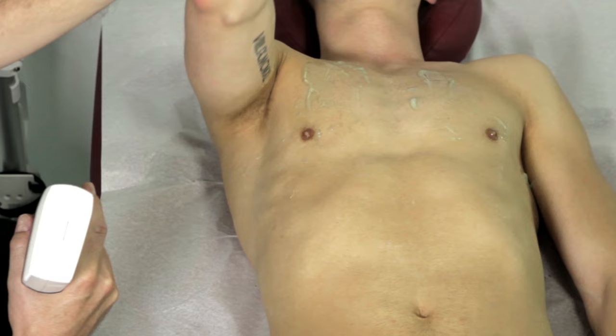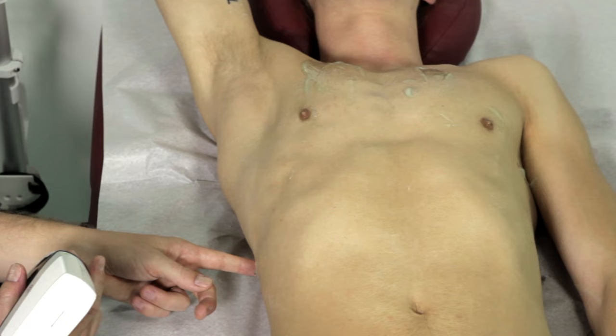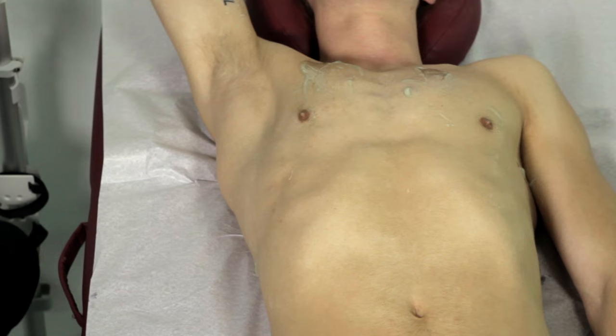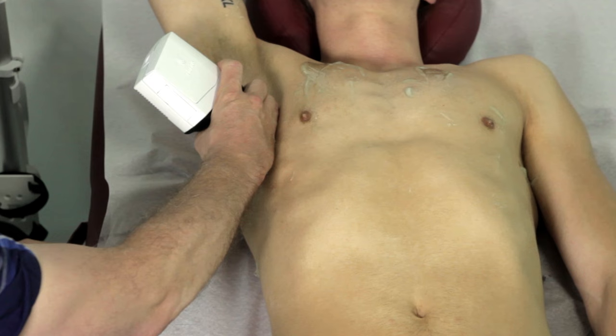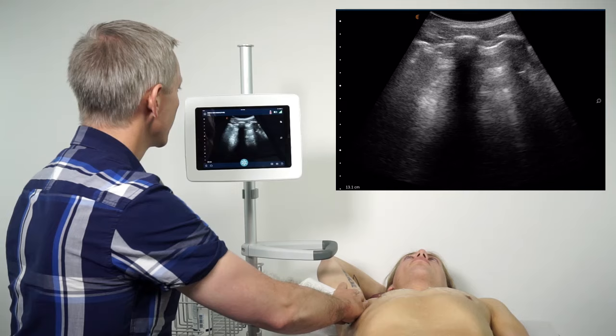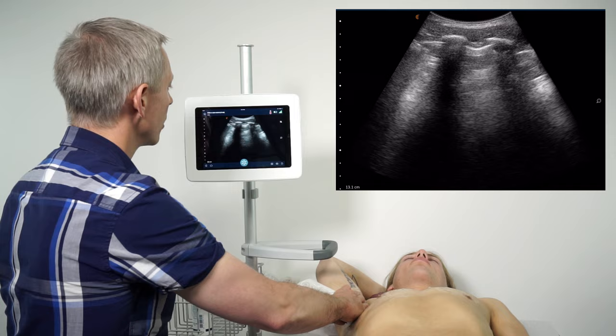I'll move on to the lateral lung zone. I'll get the patient to place his hand above his head, exposing the lateral aspect of the chest. The lateral lung zone is divided by the anterior and posterior axillary lines, and again I'll divide it at about the level of the nipple into superior and inferior portions. For the superior zone, I'll place the transducer in about the mid-axillary line, getting right up into the base of the patient's axilla. Adjusting the pitch of the transducer brings out those nice A-lines and crisps up the pleural line, consistent with a normal lung scan.